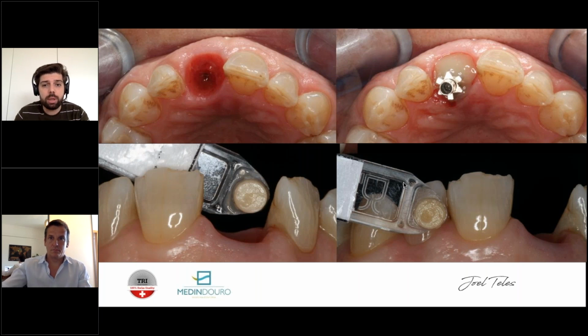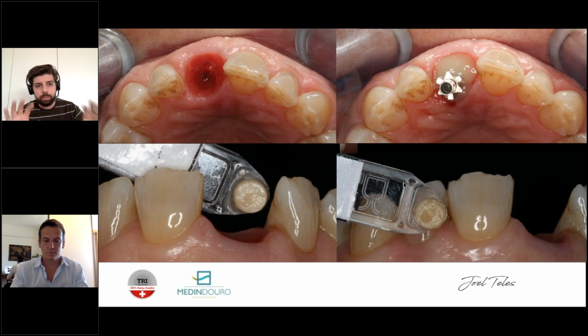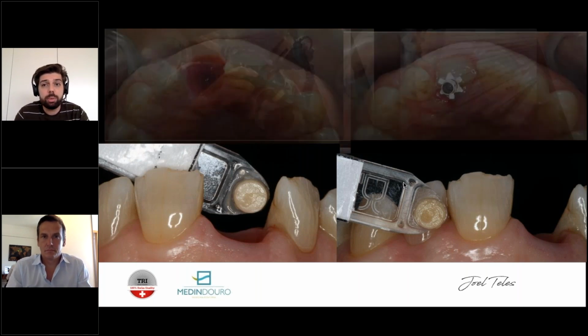So nowadays I would normally only take pictures with this. This is the ceramic that my lab is using. Even the height of the ceramic needs to be discussed with the lab because it's very important. And this is for dentin. For enamel, I have a different scale of blues and grays in order to do the opacities, the transparencies, everything to try to mimic these teeth. So it's a process that takes a while to have a team completely with the same mindset, but after that it's very easy and it takes almost no time.